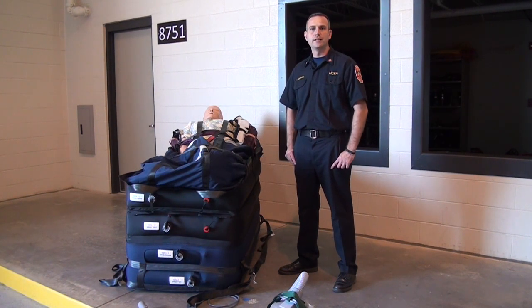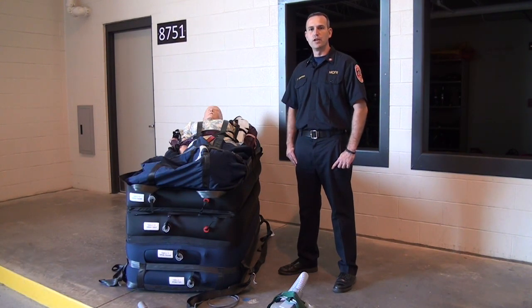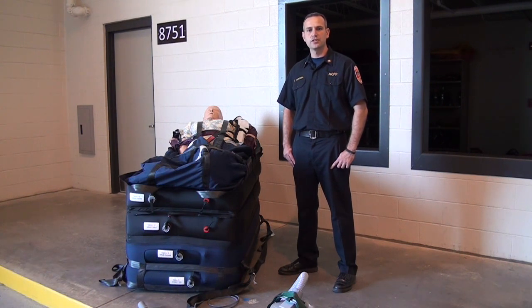The device is rated to carry up to 1,200 pounds on a flat surface. If we use this device to lower patients downstairs, then the load capacity of the device is cut to 700 pounds.